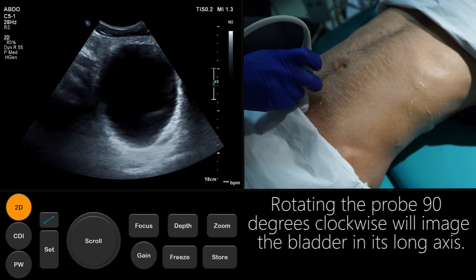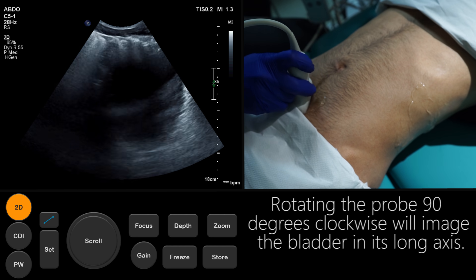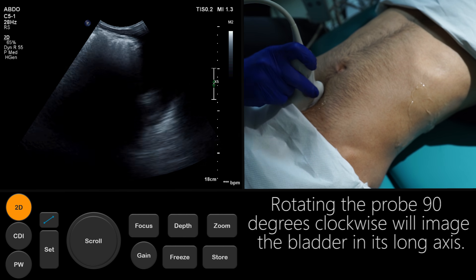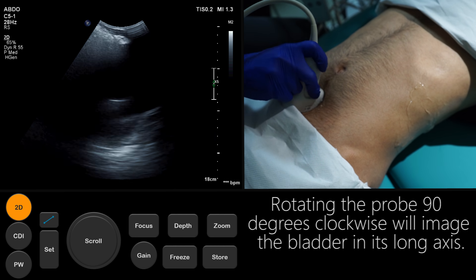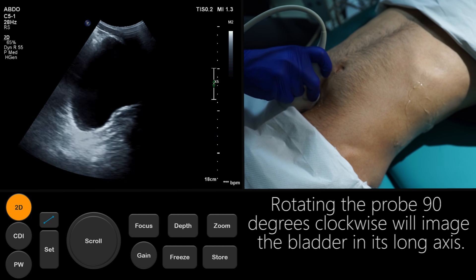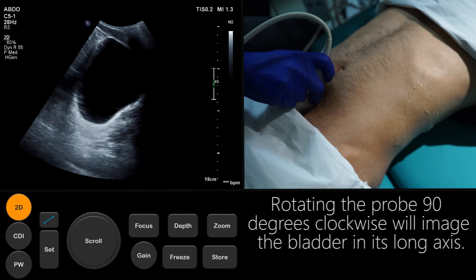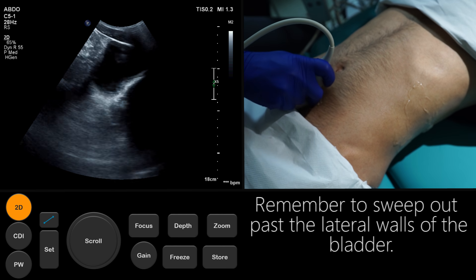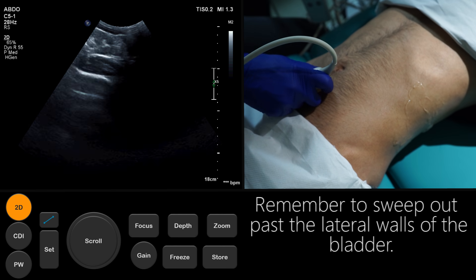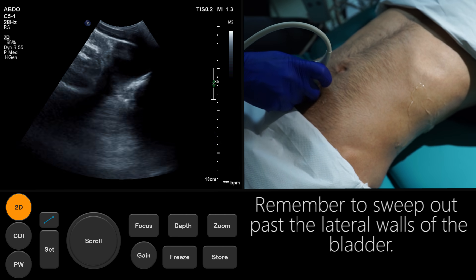Rotating the probe 90 degrees clockwise will image the bladder in its long axis. Remember to sweep out past the lateral walls of the bladder.